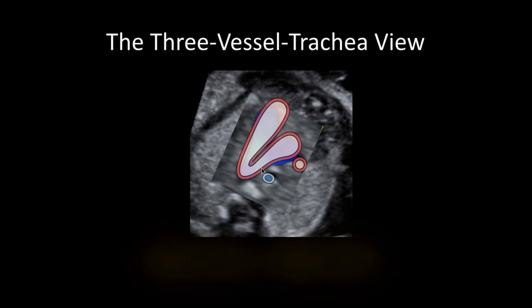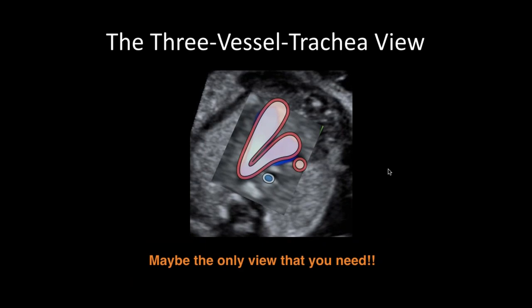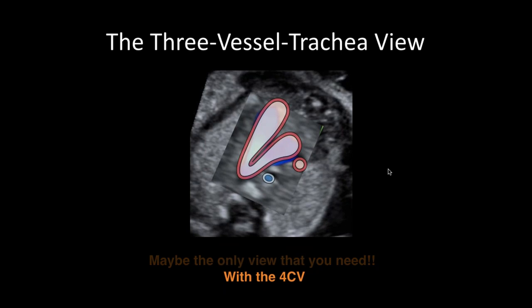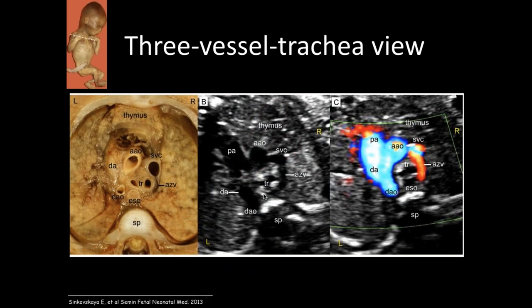This is a very important view. This slide shows an anatomic specimen at the level of the three-vessel trachea view, the corresponding ultrasound in grayscale mode, and the corresponding ultrasound in color Doppler mode. I want to highlight the pulmonary artery, ascending aorta, superior vena cava, the ductal arch, the aortic isthmus to the descending aorta. In this view, you see the azygous vein as it drains into the superior vena cava. Note the location of the trachea — the ductal arch and the aortic arch are to the left side of the trachea.